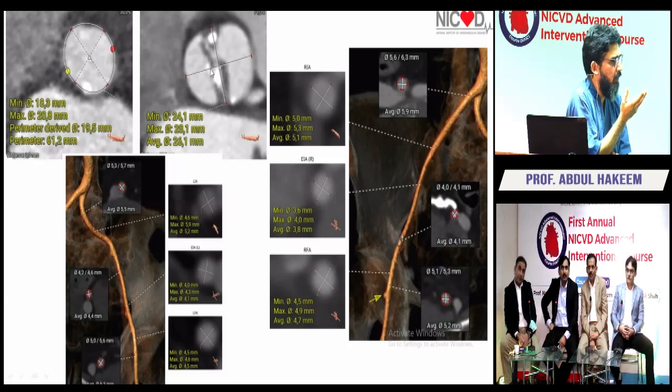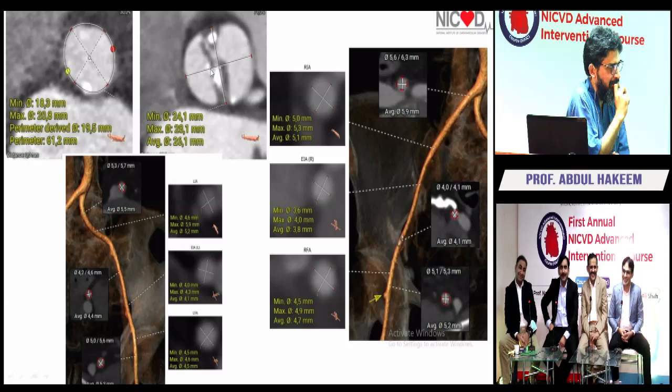Okay, just to answer your question, her subclavians are 3 and 3.5. And that's out of the question. Okay. How about transcaval? What is your experience with that? I've never done a transcaval in my life. Zero experience.